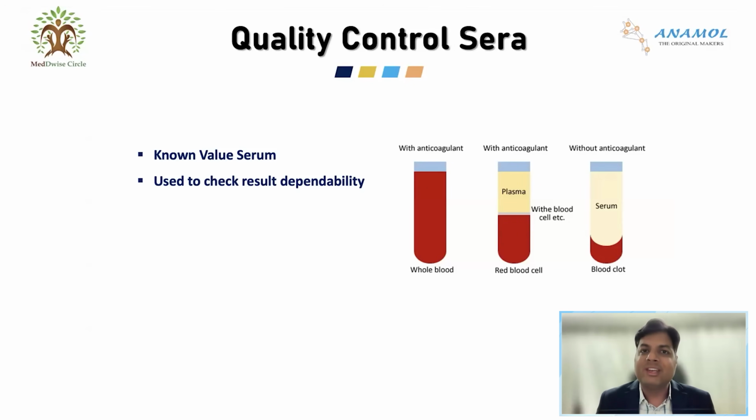So if my heaviness is, for example, 50 times more than the weight of 1 kilo, then the machine will tell that my weight is 50 kg. So in short, we have one known value weight, which is very, very important to calculate an unknown weight.